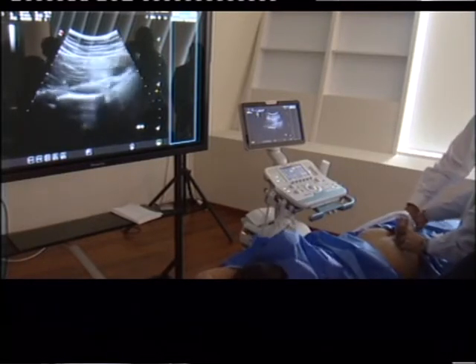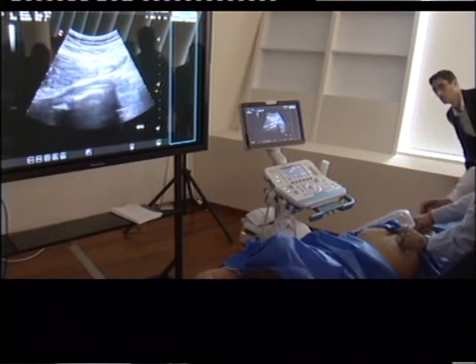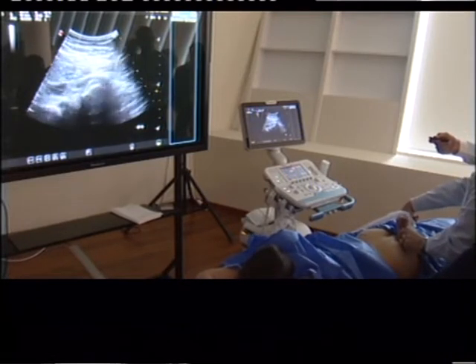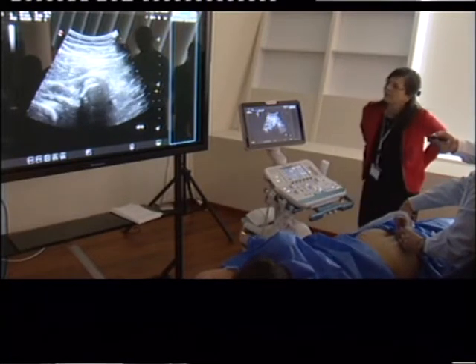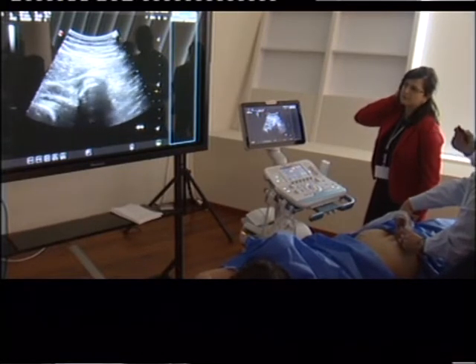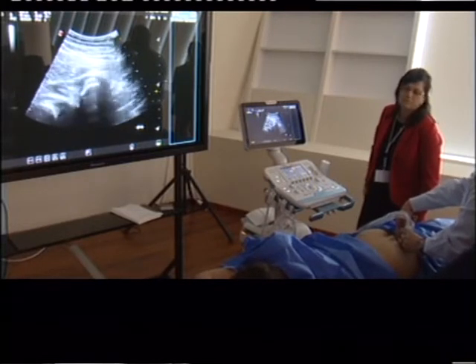So if you see the waterfall, right there is the waterfall, you come in to the bone here, and then inject here into the tendon and muscle. But you don't want to inject too much because then you block the sciatic nerve, and then you have to buy them lunch or dinner because they can't walk.